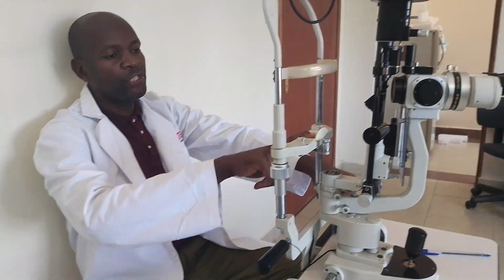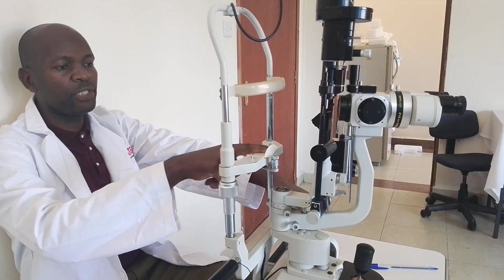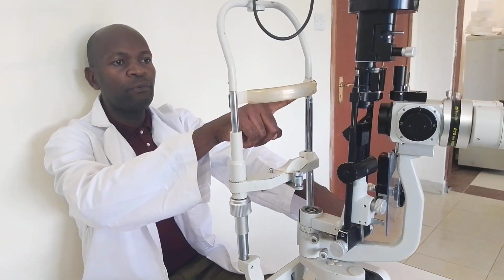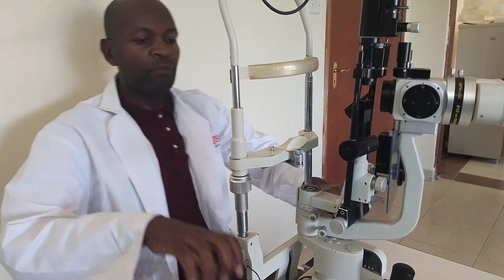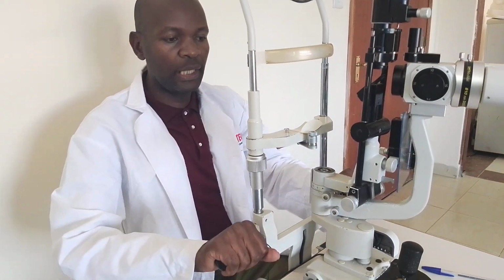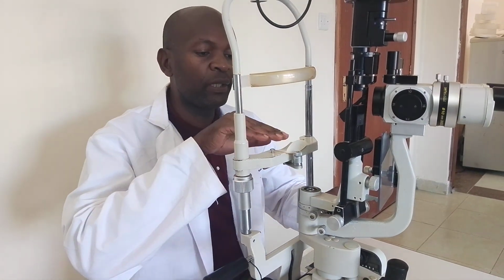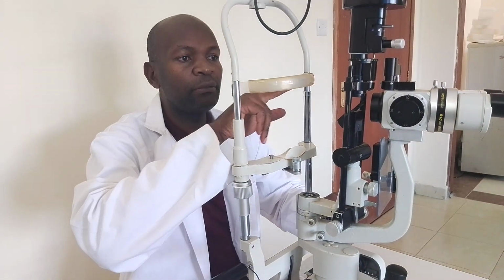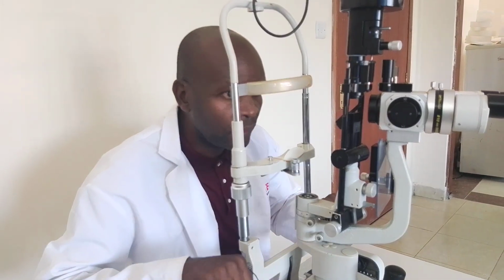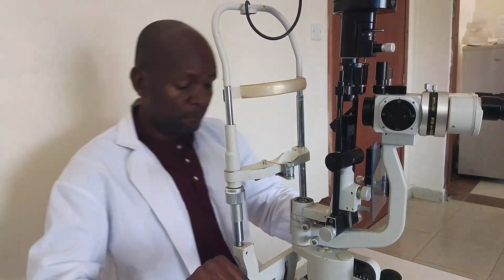Then we have what we call the chin rest. This is the chin rest, and this is the forehead rest. So the patient sits here, holds on the handles, and then positions like this. You realize that the chin touches here. This is what we call the chin rest, and the forehead is supported by this structure here, which we are referring to as the forehead rest. So the patient positions like that.